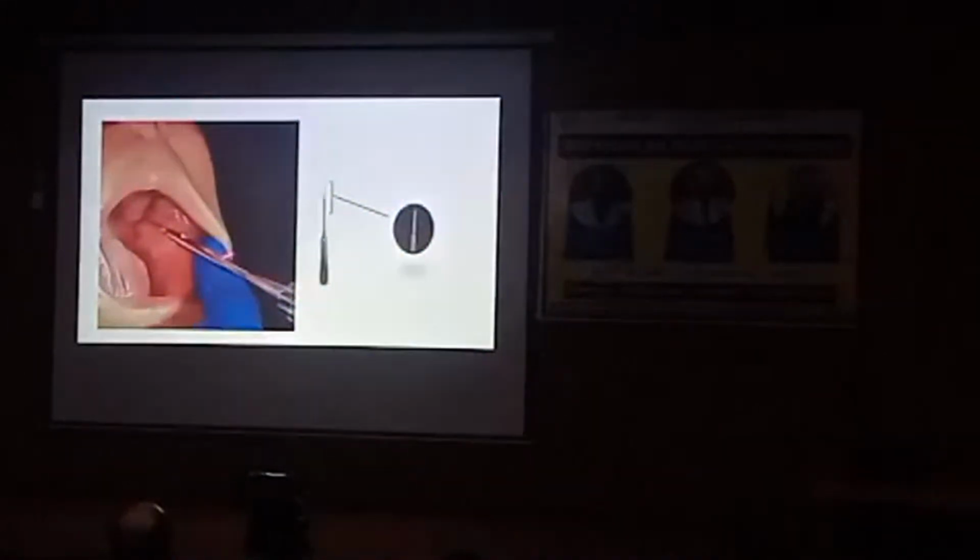So this is one handle in which you can hold your drill, the basic 2 mm long lance drill. It attaches well there. I'll show you every arm that I'm talking about. So this is how you palpate. Here could be our hamular process. From there we went distally on the center of the ridge. I decided my vertical angle and the horizontal angle, and with this hand instrument we will find the pterygoid plate and we will perforate it with the drill only.